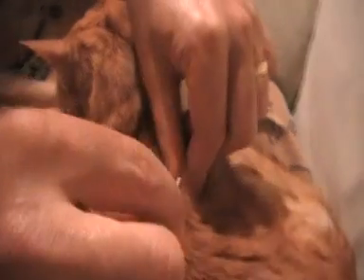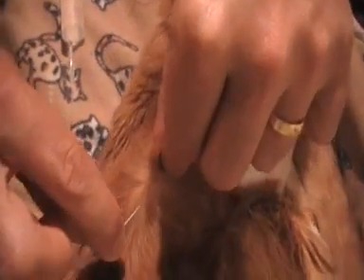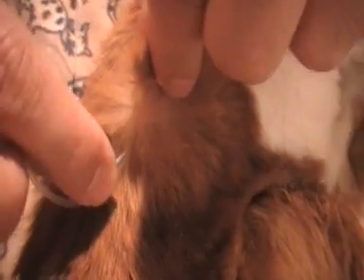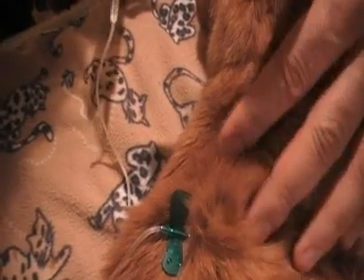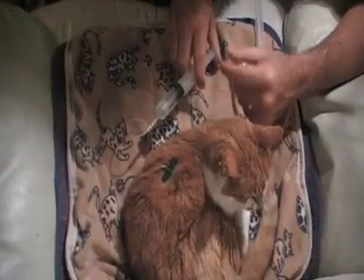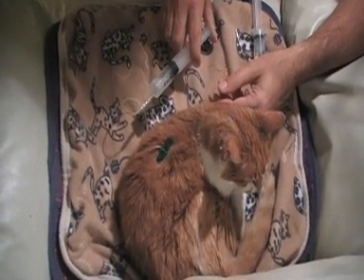Tiga's just sitting here nicely. Just going to grab her fur and pull the skin up to form a tent. Then we're going to go to the bottom of the tent and just insert the needle into there — nice and easy, just underneath the skin, in the pouch of the dermis. Once it's there, she's just nice and calm. Slowly inserting the fluids. They usually purr because it's a nice warm sensation for them.